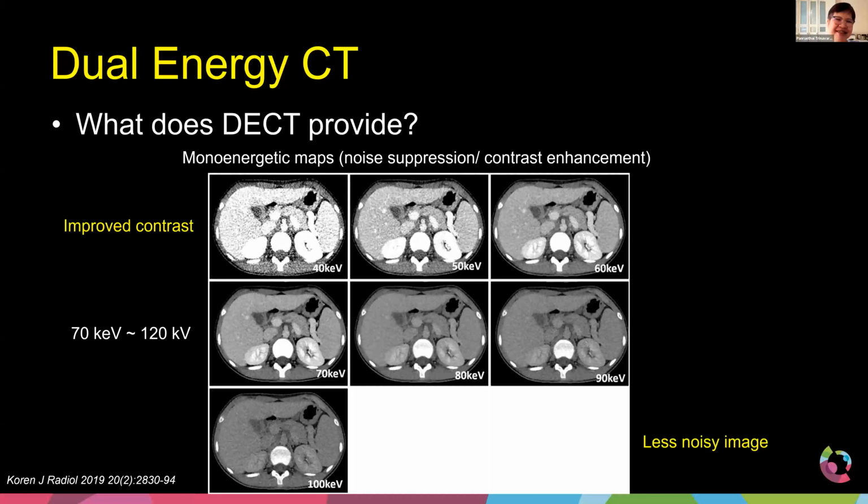I think that in the case that we cannot get the intravenous access, that is very good, and can be like a slow flow injection or something. Yeah. But to be honest, here in the US, we do not do a lot of dual energy in kids. We just don't. The doctors and hospitals are still looking for that clinical indication that makes a lot of sense for dual energy. So hopefully we'll get there one day.